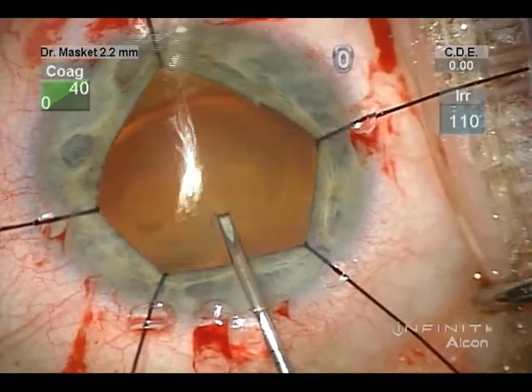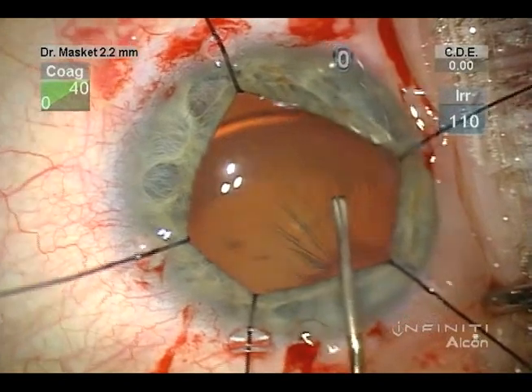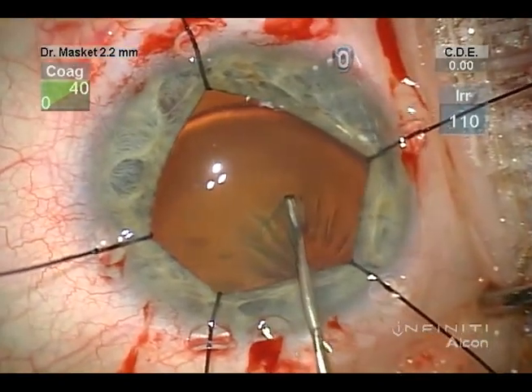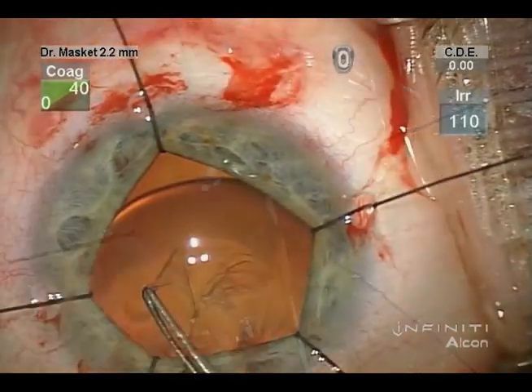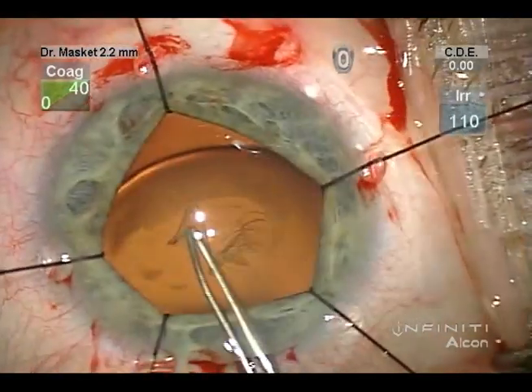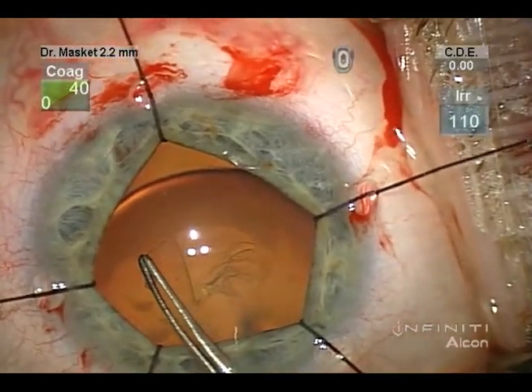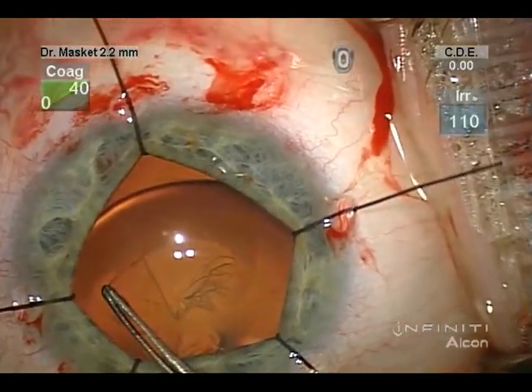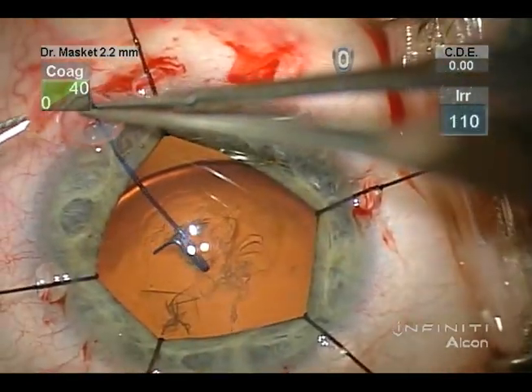It is important to generate the initial capsule tear in the direction toward rather than away from the zonular weakness, so as not to tear additional fibers. It is difficult to propagate the capsulotomy absent a significant strength of the zonular fibers.